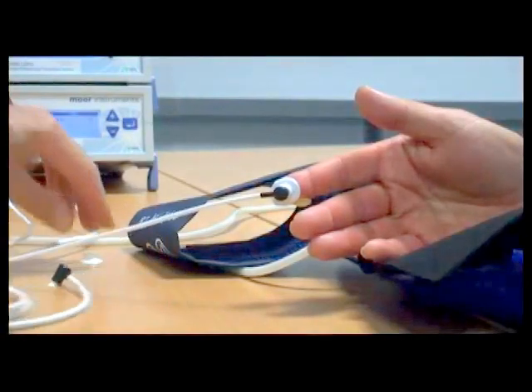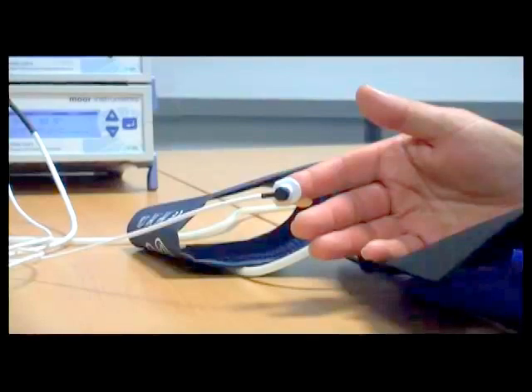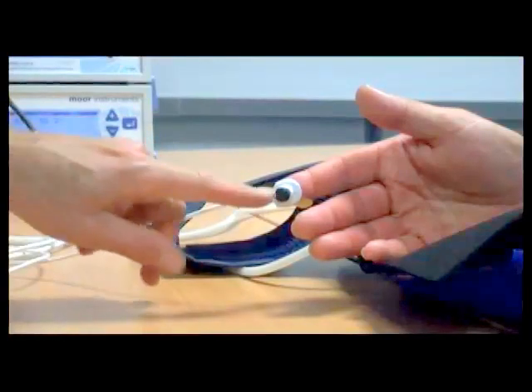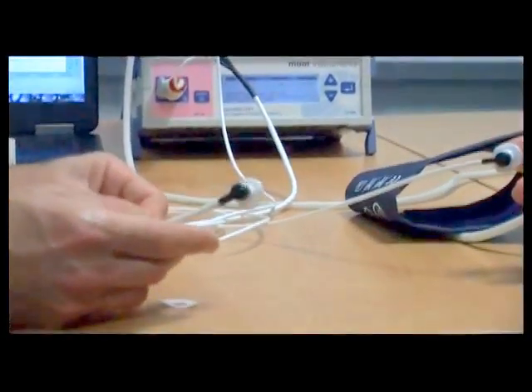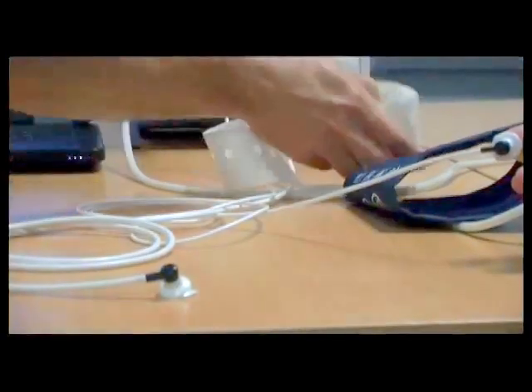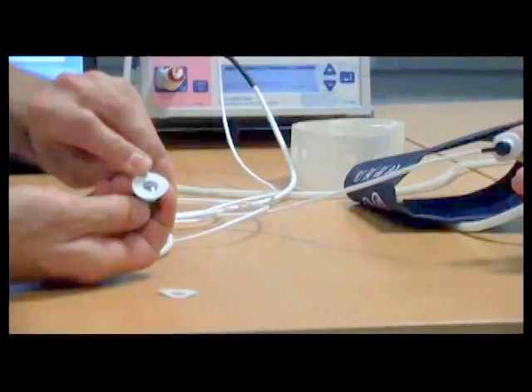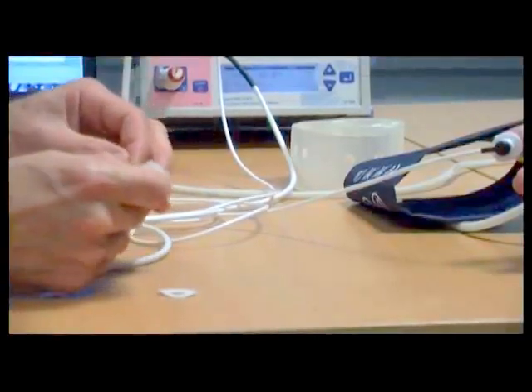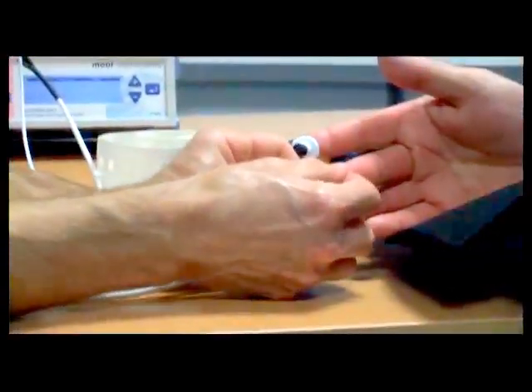We do the same with the standard blood flow and tissue oxygenation probe as well. This probe is for the high power blood flow measurement, and this is for the standard power blood flow measurement and the oxygenation measurement. So again, we take one of these adhesive discs, apply it to the probe tip, remove the backing paper, and once again attach to one of the digits, like so.